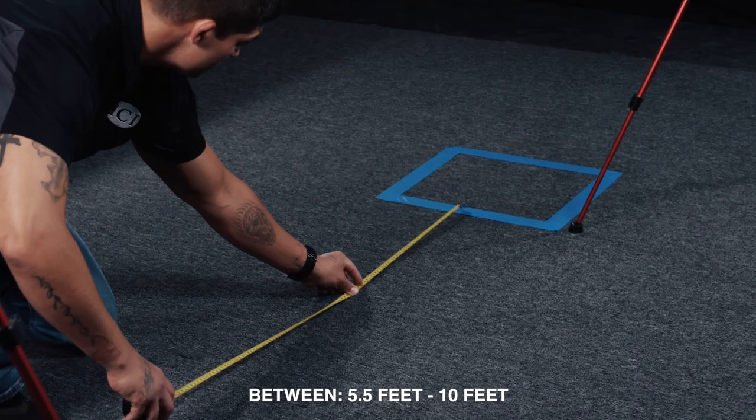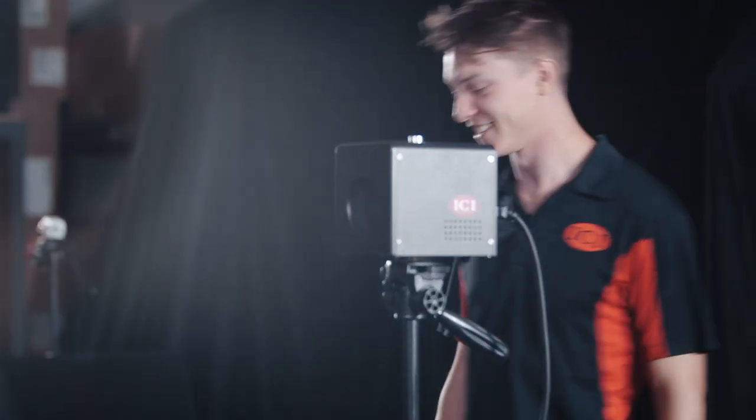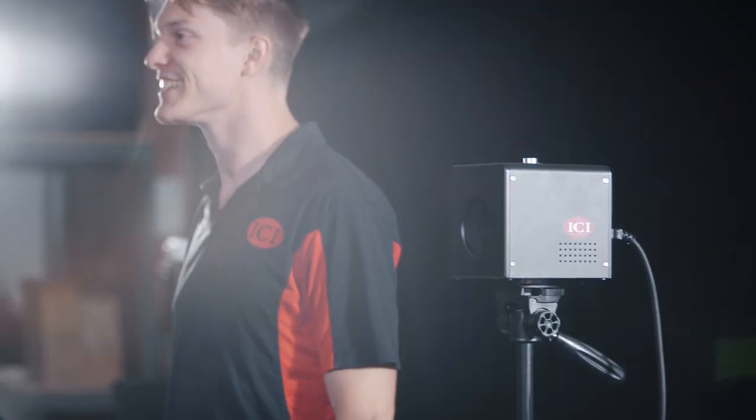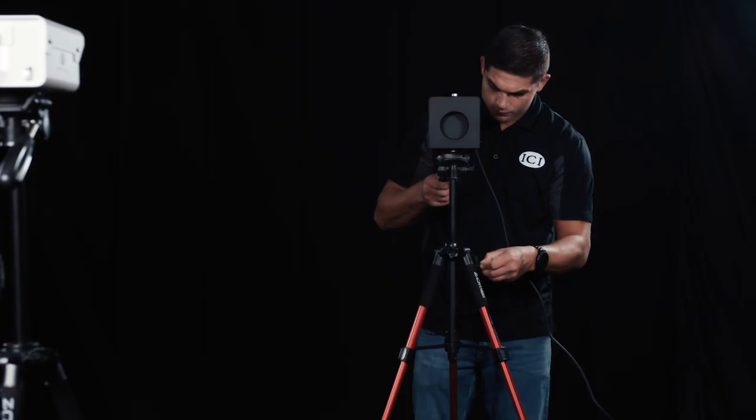Depending on the unit, the focal distance will be between 5.5 feet and 10 feet. Traffic flow to and away from the screening point should be well marked. Remember, all equipment should be set up in conjunction with a homogeneous background. The system must be set up correctly to accurately screen individuals for an increase in body temperature. Proper focal distance, height of the equipment, and the relationship between the camera, the temperature reference source, and the individual are essential for successful temperature screening.